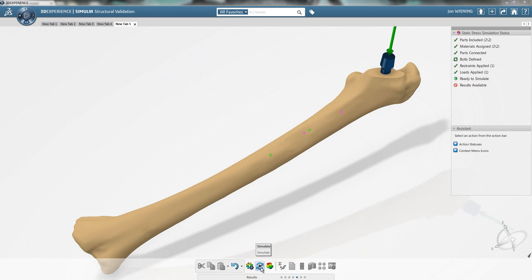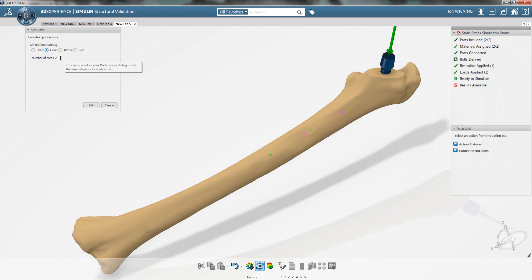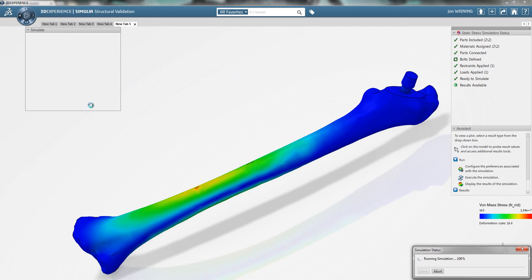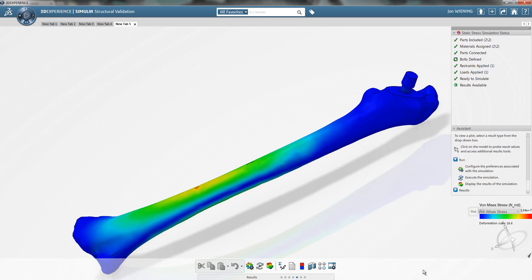Now I can click on simulate to bring up options to run the simulation. I can choose the simulation accuracy from draft to good to better to best, and choose the number of cores. In this case, I'm running on two cores and I hit OK to start the simulation. With the simulation now complete, I can look at the results.